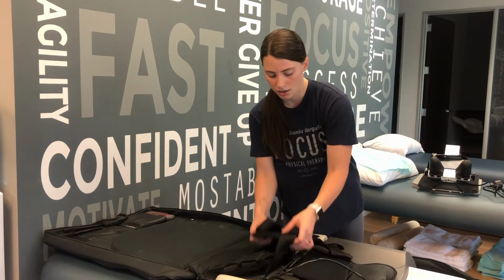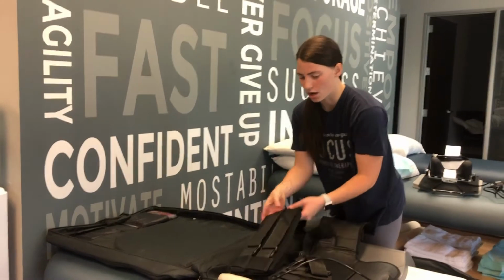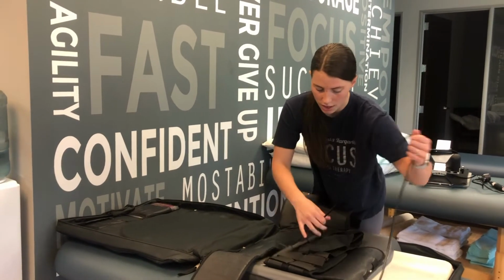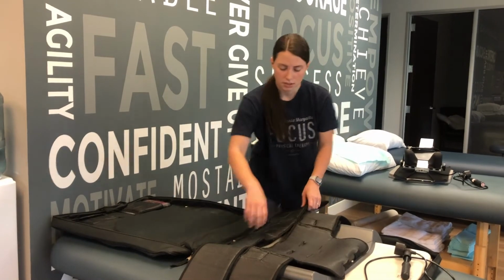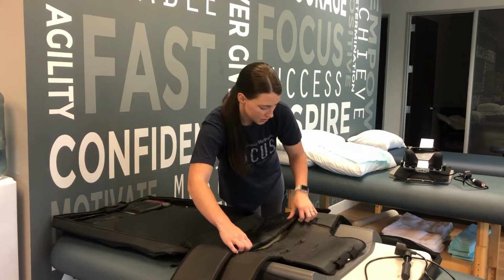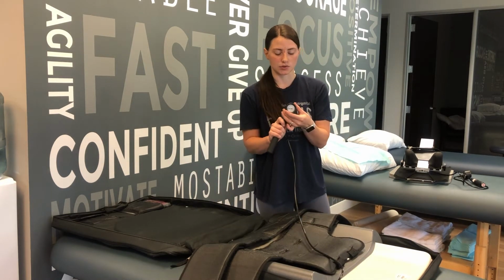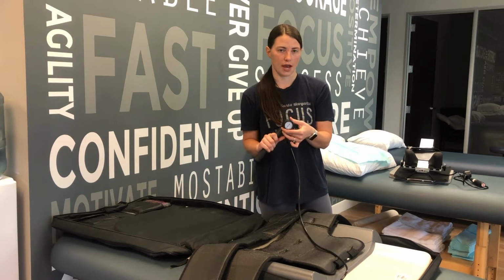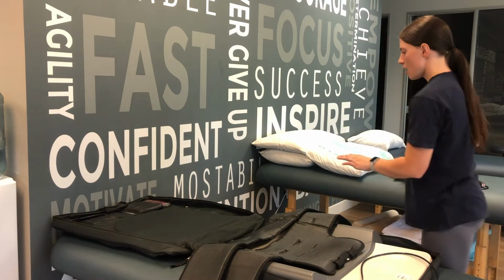From here, we've got the straps that go around the patient's abdomen. I want to make sure that those are all laid out flat, and then just kind of in line with each other. And it has the same pump setup as the cervical traction. So it has those three settings: the middle where you pump up, the left where you lock, and to the right to release it. So it's that same kind of setup.